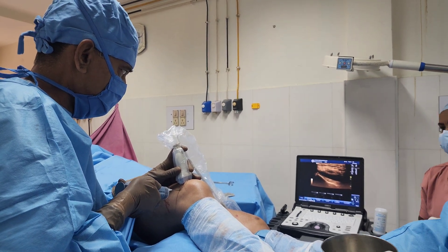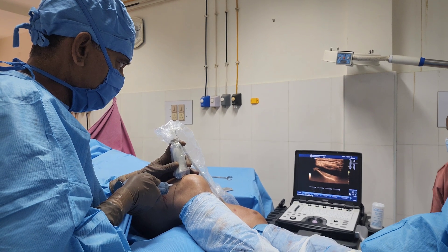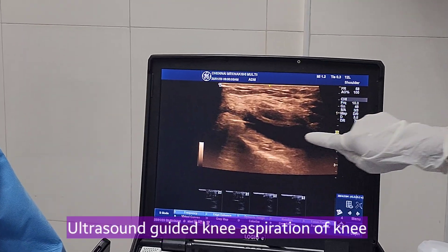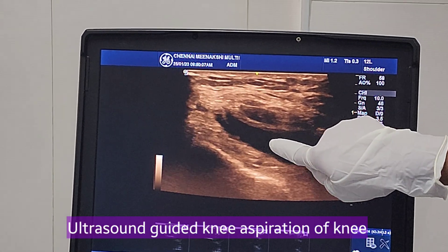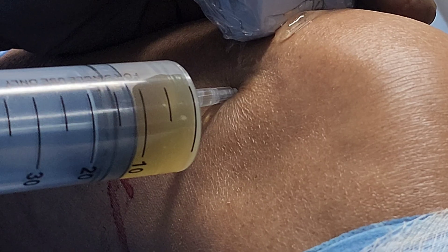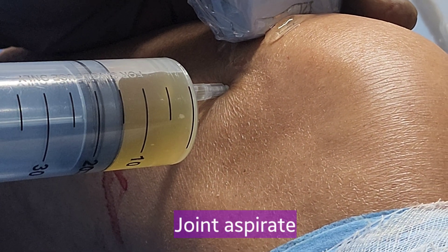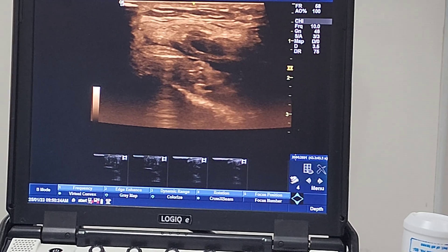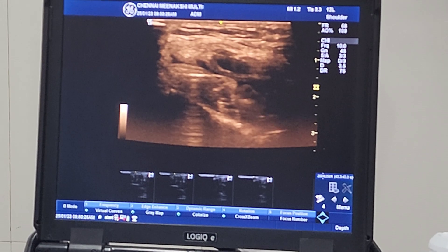I am inserting the needle. The needle is inside the effusion. Now, I am aspirating fluid. Fluid is coming out easily and you can see the knee effusion is getting empty.